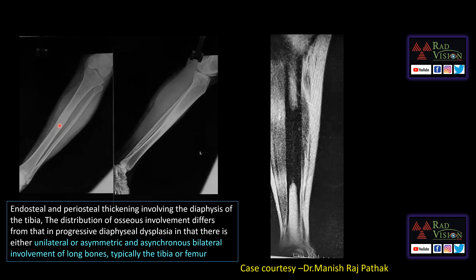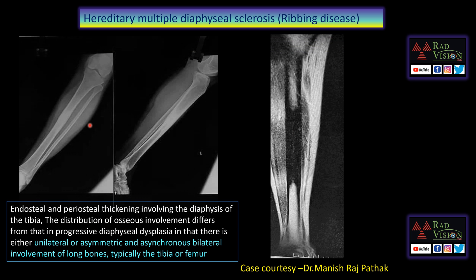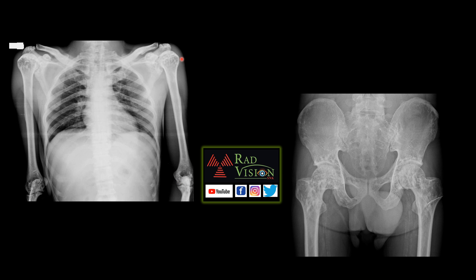The next case shows diffuse endosteal and periosteal thickening involving the diaphysis of the tibia. On MRI there is hypointense diaphyseal sclerosis with medullary cavity narrowing — thanks to Dr. Manish Raj Patak for contributing. This is hereditary multiple diaphyseal sclerosis or Ribbing's disease, which resembles progressive diaphyseal dysplasia but with unilateral or asymmetrical and asynchronous bilateral involvement.